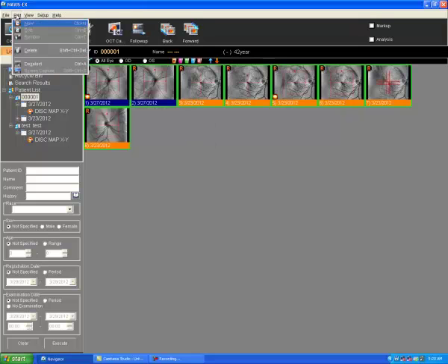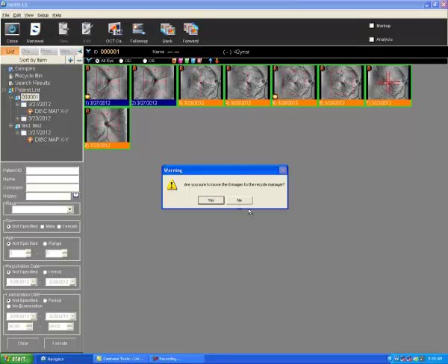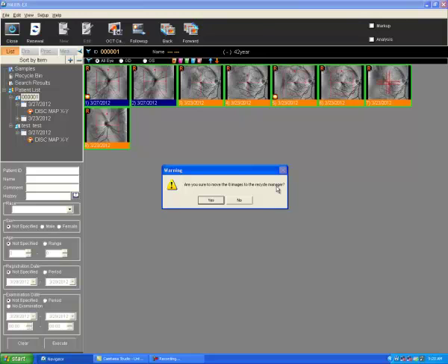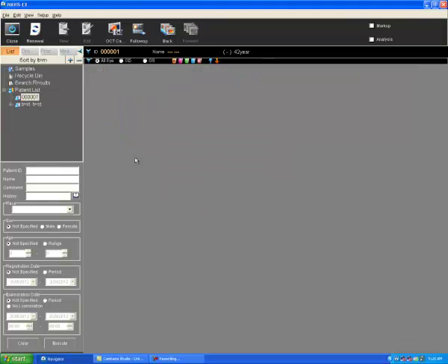What we'll do then is delete the scans. We'll go up here to edit, shift control delete. It will ask are you sure you want to send these to the recycle manager. Now the recycle manager is a system of organizing deleted files. So even though we are deleting, we will still have access to them, which is reassuring to know. So I'll select yes.